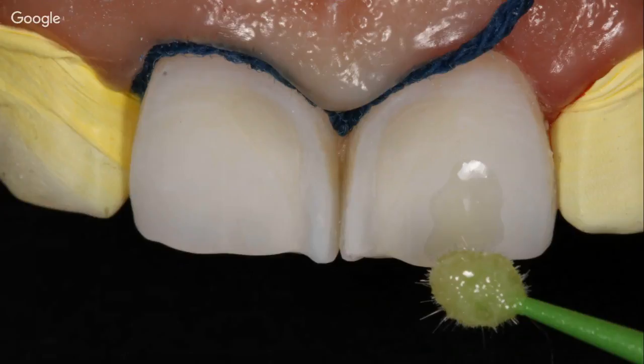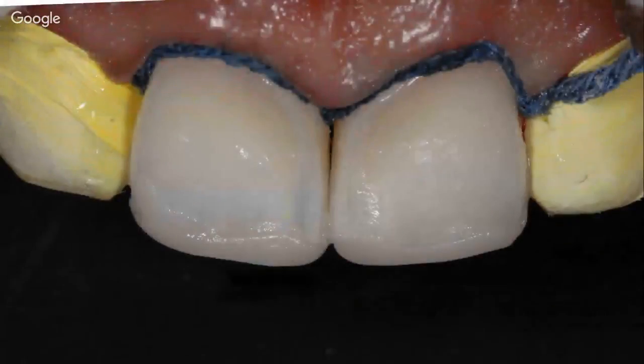And again, that's another topic, but I seriously do believe in the importance of magnification. With your naked eyes, you cannot see this view. This is the first layer of composite to just lengthen the incisors. And by the way, just regarding the magnification issue, I hear this comment a lot.